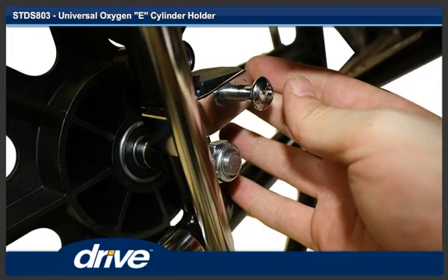Step 4. Slide the cap screw through the non-threaded side of the U-bracket and the spacer bracket.